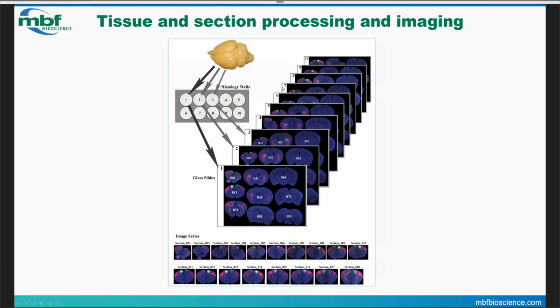So everyone, Chip Gerfen. Hi, my name is Chip Gerfen. Anyway, as Nate said, I've been doing this for a long time, and I just want to describe today both the histology processing, the imaging, and then how we use NeuroInfo to reconstruct from serial sections whole brain volumes. An advantage of the technique that we use is that this is all done on free-floating brain sections, which enables doing immunohistochemistry and things like that. And I just want to describe how we go about this.